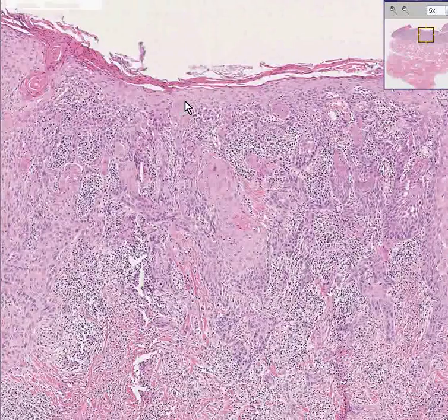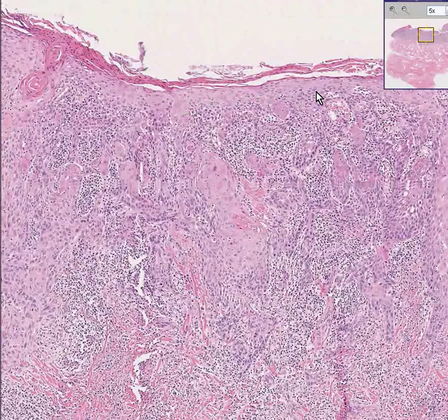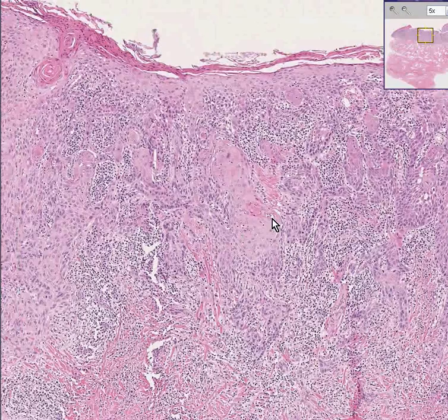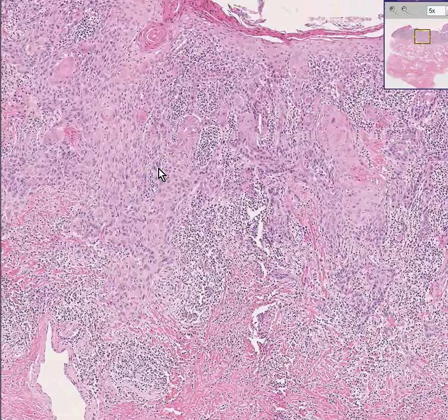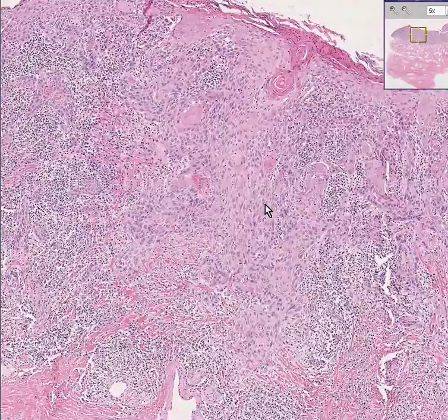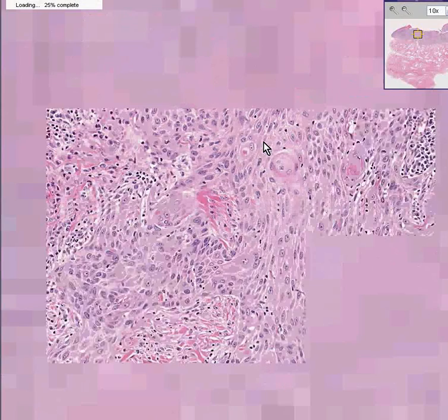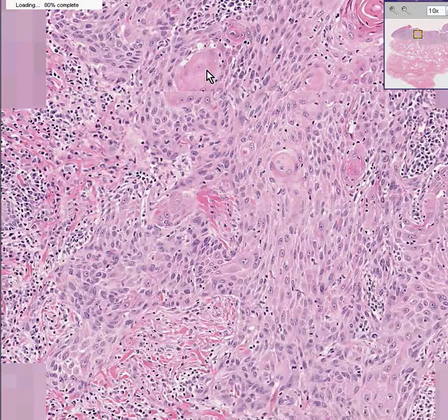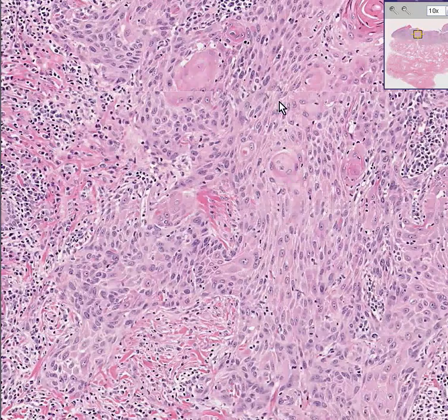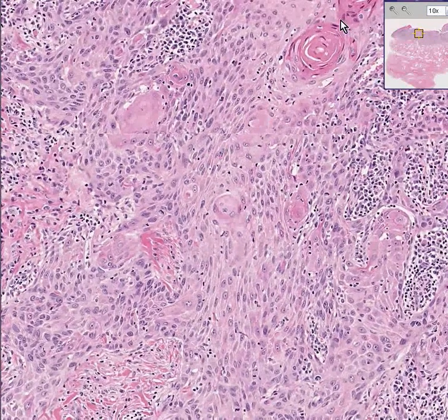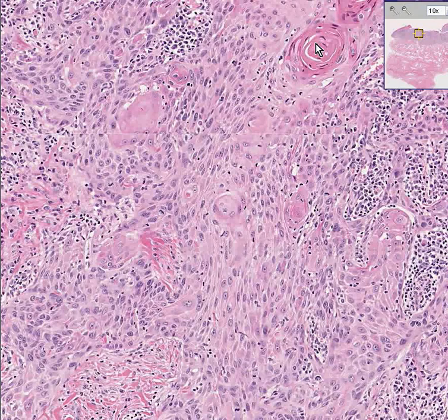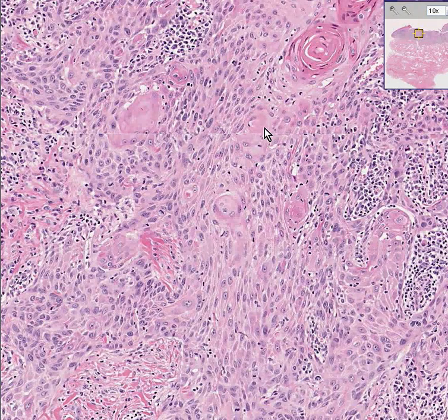Here's an area in which there is some intact epithelium, but there are still a lot of these infiltrating squamous nests. If the squamous nests form pearls — like you see here, looking like little pearls — you can say these are squamous pearls, indicating a well-differentiated squamous cell carcinoma.